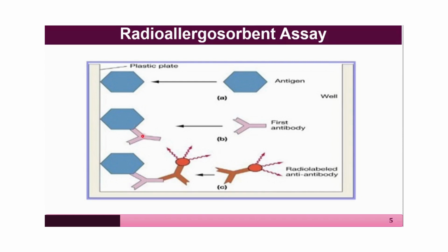The antigen-antibody complex formed is stable at a given pH and will not be disturbed. And after this wash, if the antibody corresponding to that antigen is present, it will have been bound and will be there in that well. To all the wells, now add radioactively labeled secondary antibody, which is anti-IgE antibody, raised in an animal.